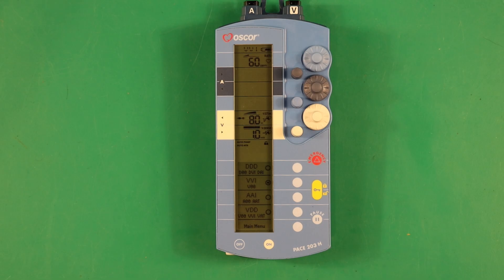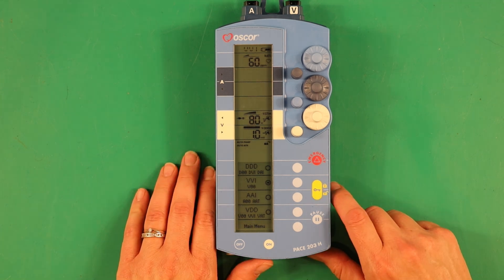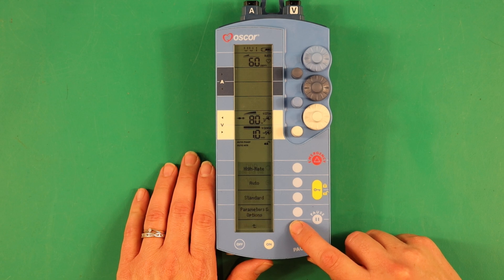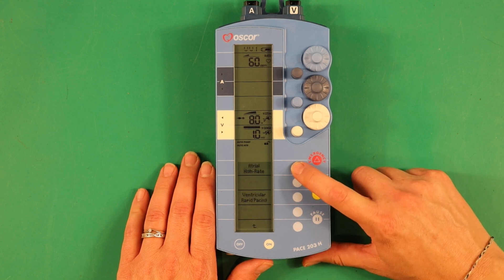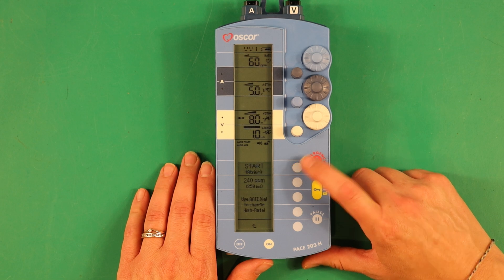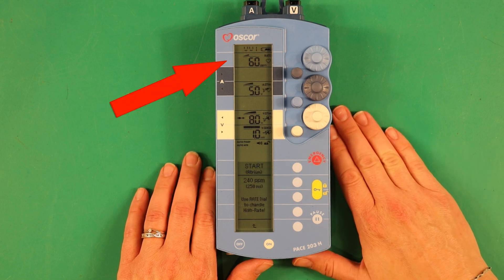The steps to pace are going to depend on your pacer box, but for this system, hit unlock, main menu, then high rate. Notice it doesn't matter what mode the box is set to. This pacer was VVI, but now the atrial stimulation is lit up.